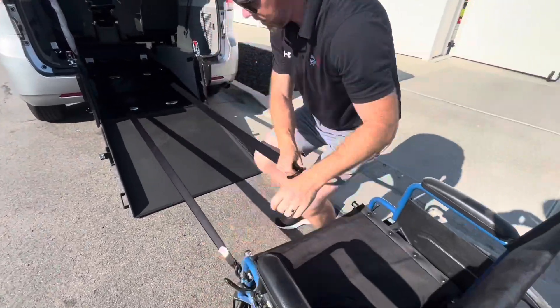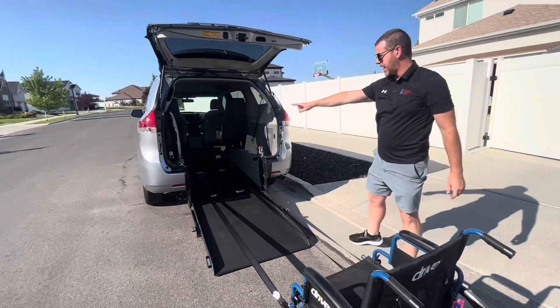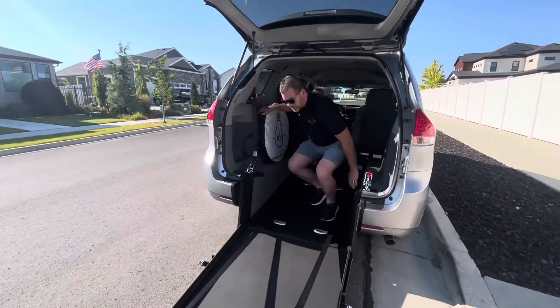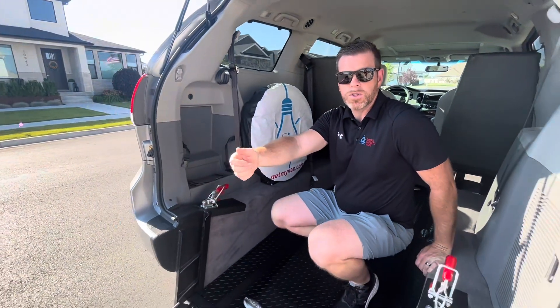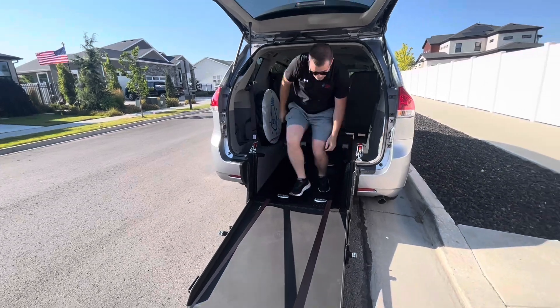So we put one on there, and one on right here. Now we're going to come back to this black button — you can see it's on right now in red, which means those will pull out freely. As soon as we turn it off, those Q-Straints will no longer pull out freely; they will only retract.